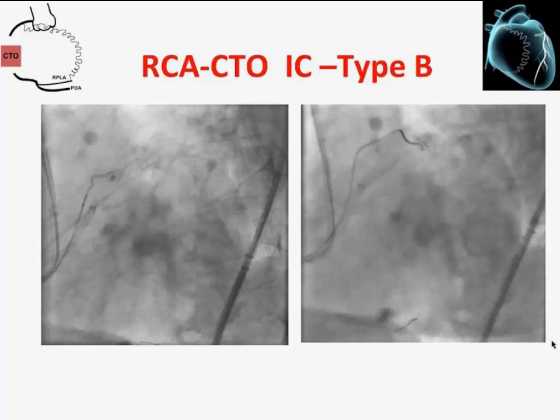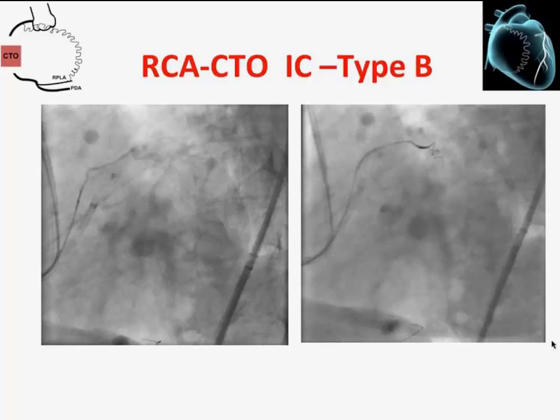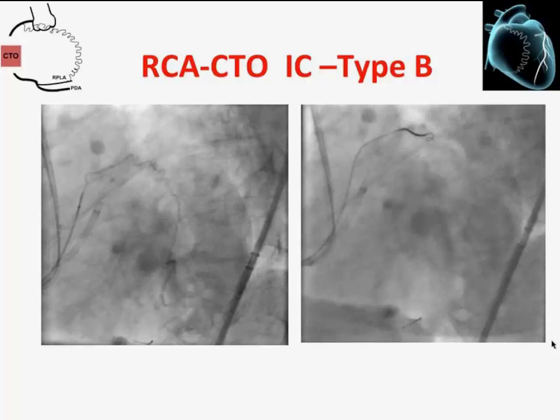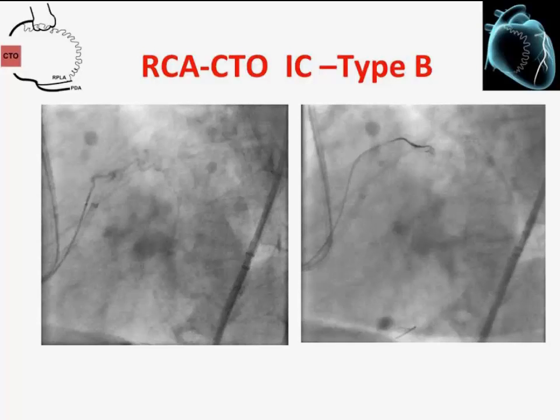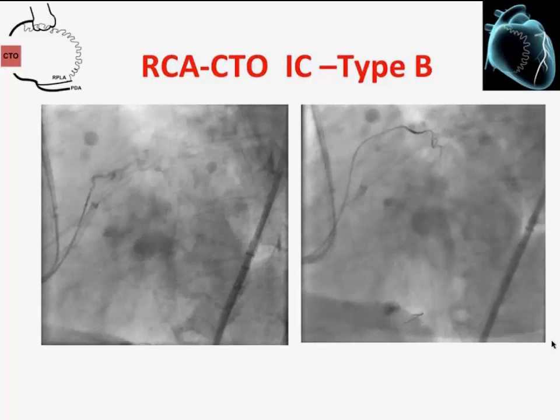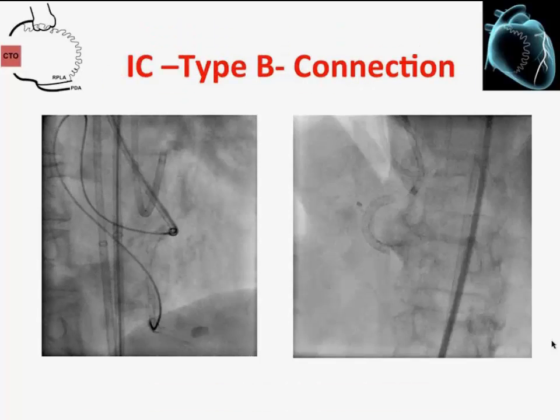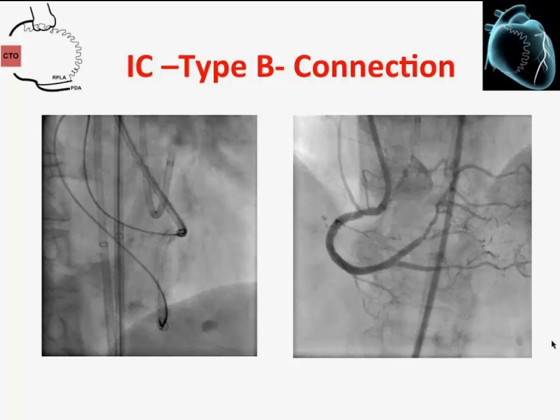So what I do is I try to bring my Corsair gently forward, and then you can go for the next loop. Have you seen it? Yeah? Okay, the Corsair comes, as you can see. So you have to be a little bit careful with the device, but then the wire jumps a little bit forward here, as you can see, and you do the next loop. And this was after externalization and after stenting the vessel. It's a really very big artery.